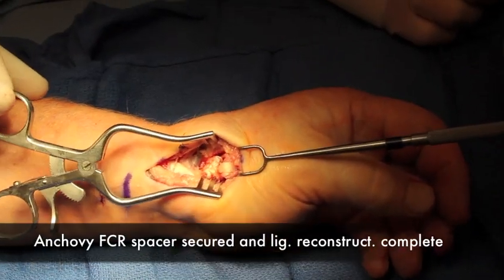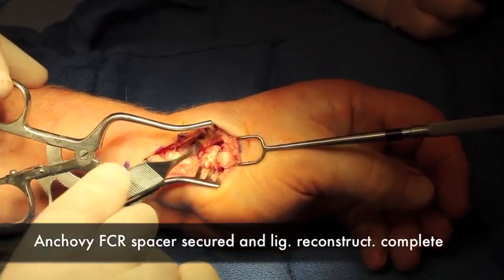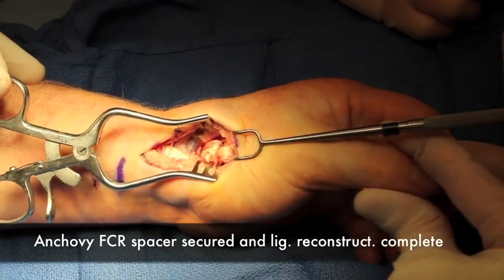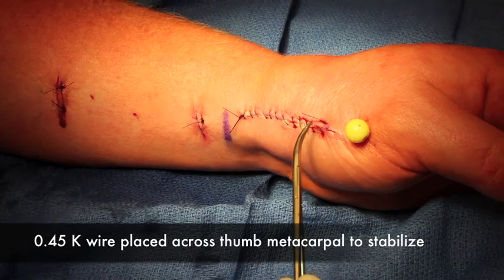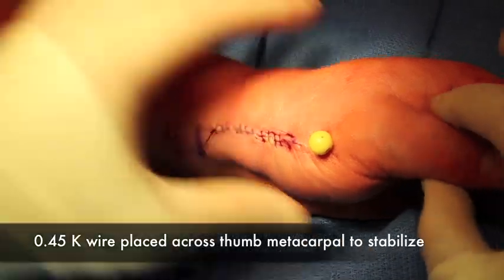Here the spacer has been placed and sutured into place. The radial artery is in the background and now there's a spacer between the bones. The wound has been sutured and a K-wire has been placed for stability.